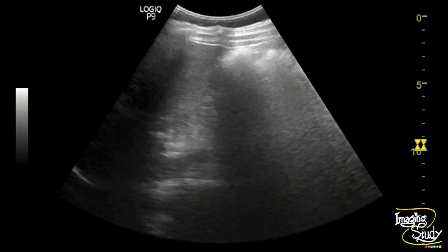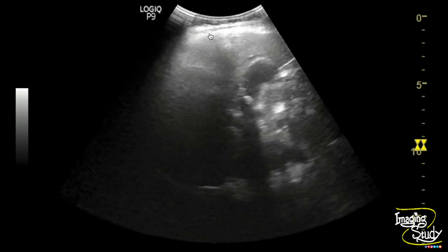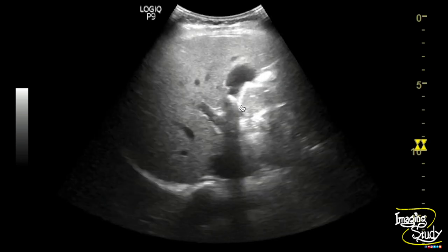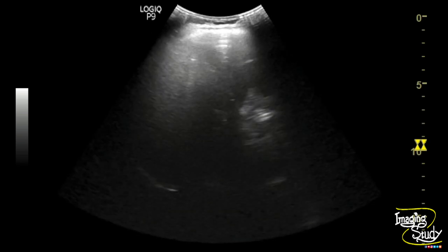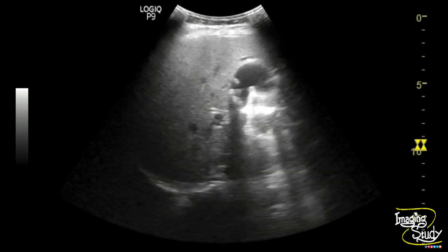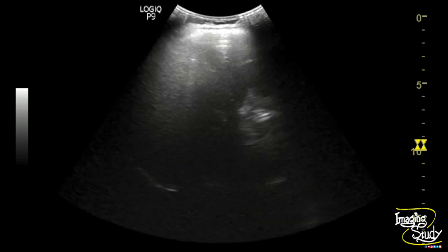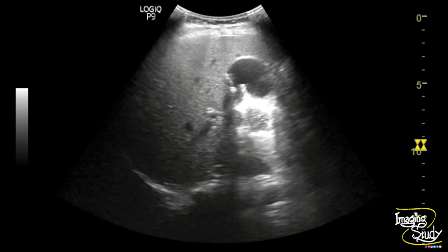The overall liver echogenicity is increased due to mild fatty change. Here I am trying to show you the magnified view of the gallbladder with hyperechoic structures casting posterior acoustic shadow within the lumen.